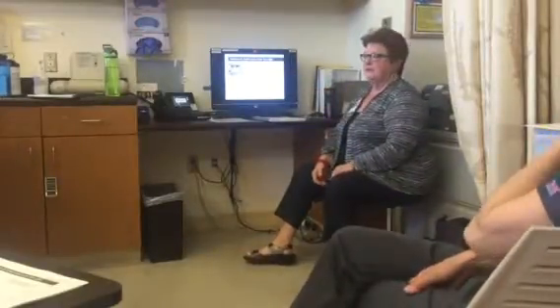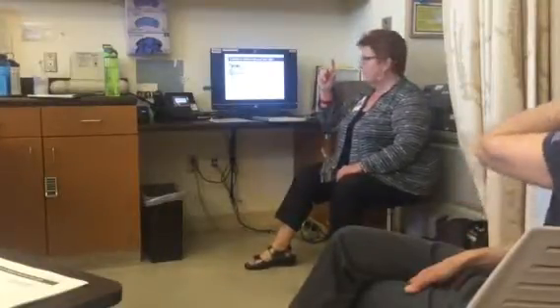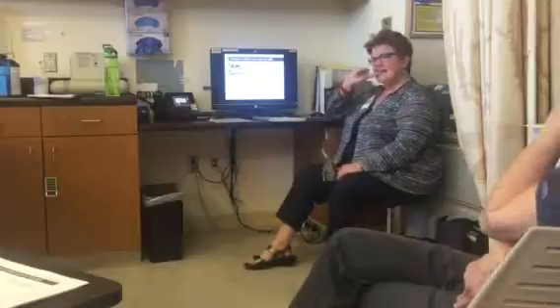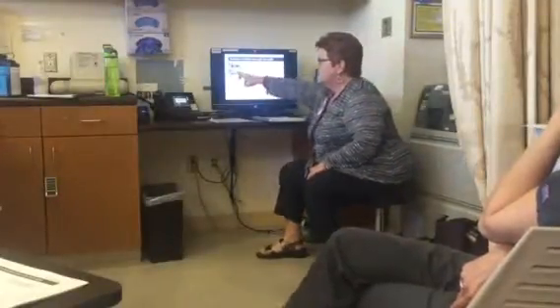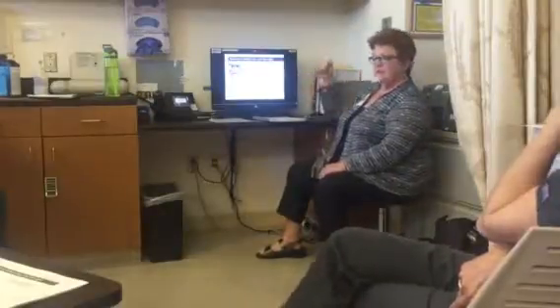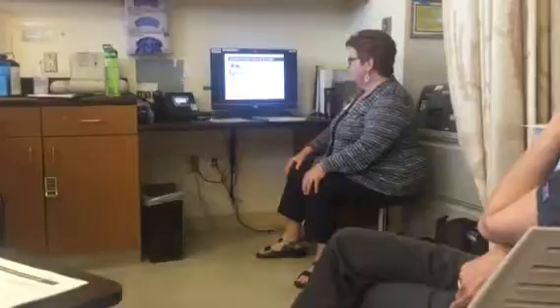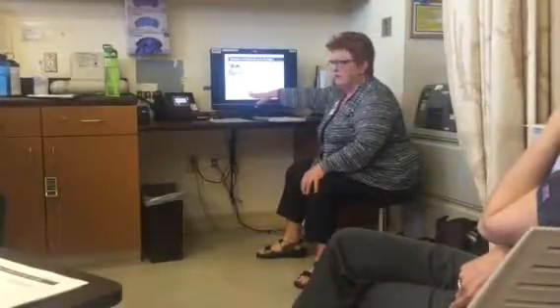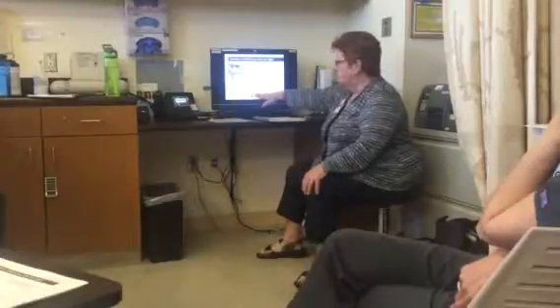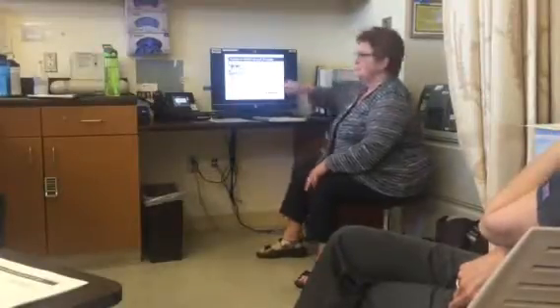Here's the other one. The contents in your collect might look too light. What are you gonna do? Up the plasma? Collection preference. If this is looking too light, what are you gonna do? Decrease the CP, decrease the collection preference, exactly. And if you have lowered the collect pump flow rate below 1, then it's suggesting that you let it reset to the default. But typically this is your problem right here, right? The CP was just too high.